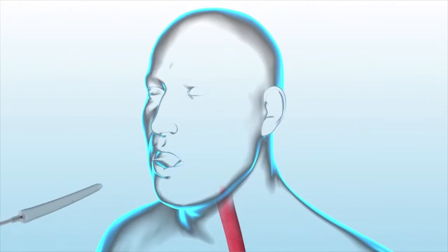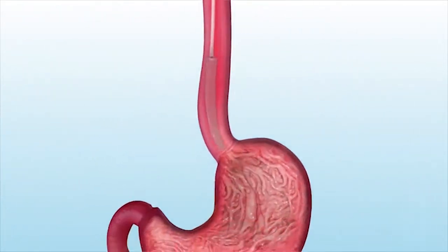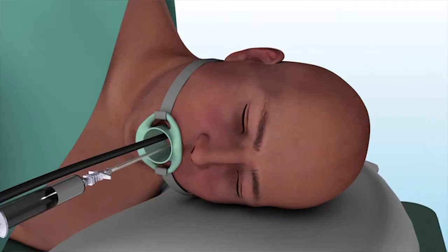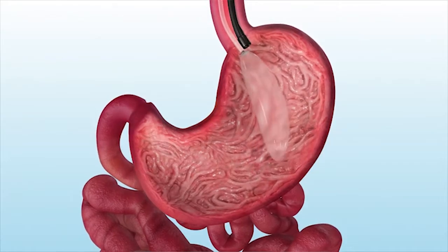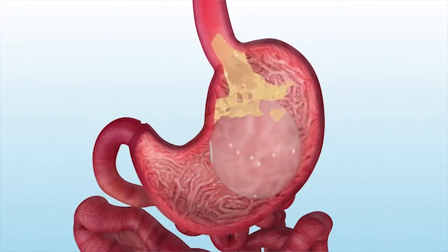The Intragastric Balloon is a soft balloon made of latex-free silicone material designed to help with non-surgical weight loss. During an endoscopic weight loss procedure, the balloon is passed through the mouth, the esophagus, and into the stomach. Once the balloon is in place, it's filled with fluid and the balloon occupies space in your stomach, making less room for food and making you feel full more quickly.